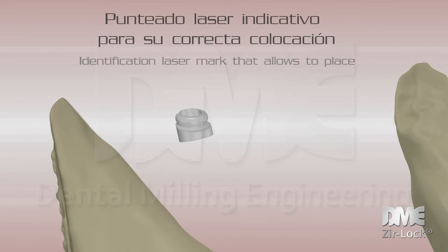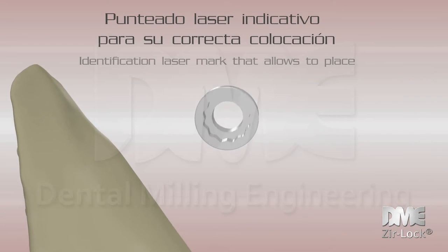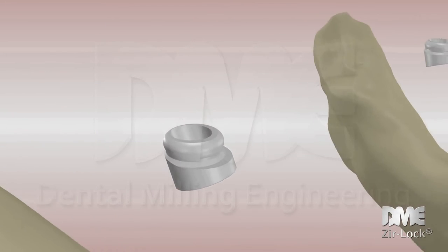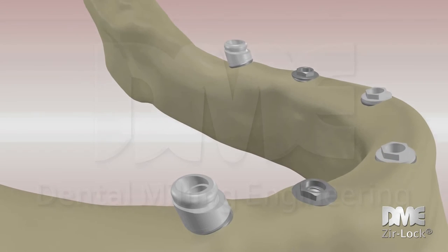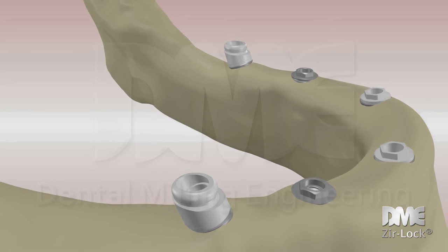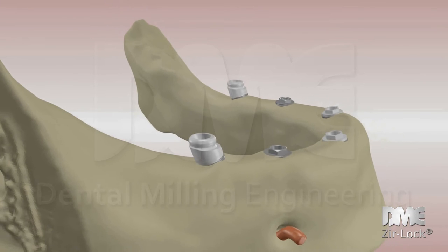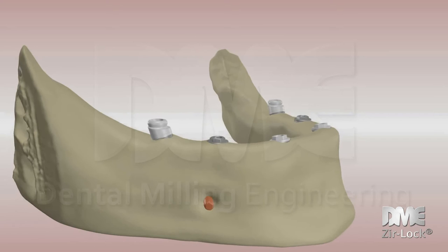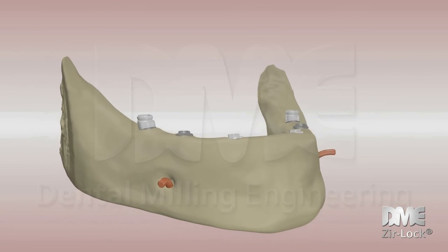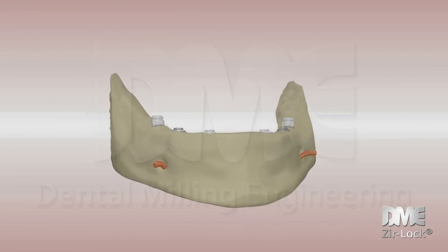Zir-Lock angulated males have an identification mark that allows to place the Zir-Lock male in the same direction as the angle of insertion of the screwdriver. That is, if the implant has its medial distal insertion, reference will always be situated distally, as you can see in the video. On the angulation correction technique, you can find informative videos and case studies on the website of Dental Milling Engineering, explaining step by step the angular correction in more detail.